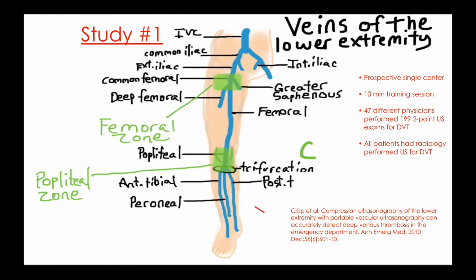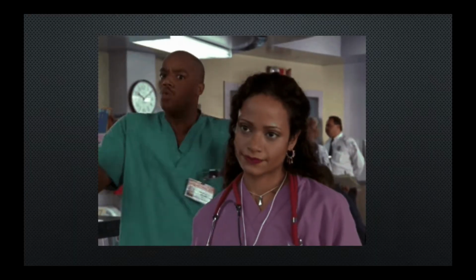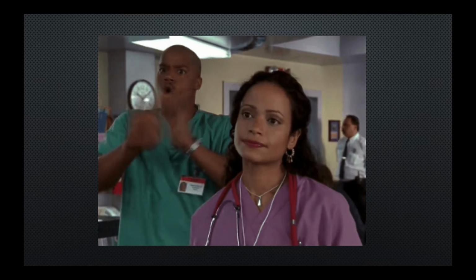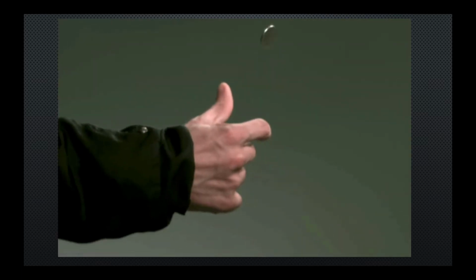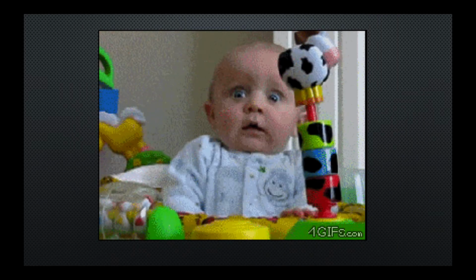How well do we trust our bedside ultrasound compared to vascular lab ultrasounds? Originally, we thought this was quite amazing and the literature coming out was a bit too good to be true. Studies started coming out using residents and students with only brief training, and the numbers got worse. They were about as sensitive as a coin toss. When there was a large clot, they saw it about 90% of the time. So a lot of physicians shied away from the exam for a couple of years.